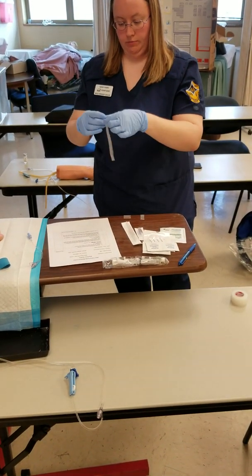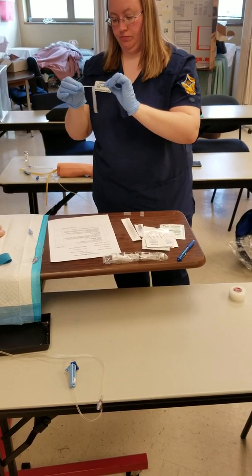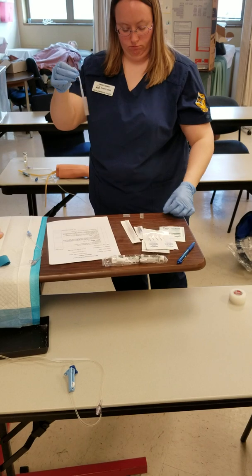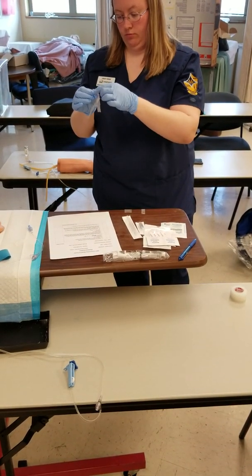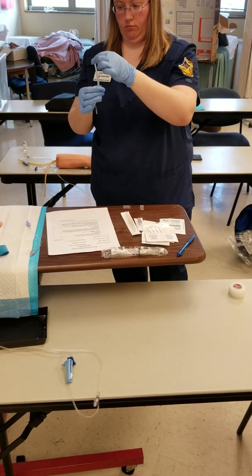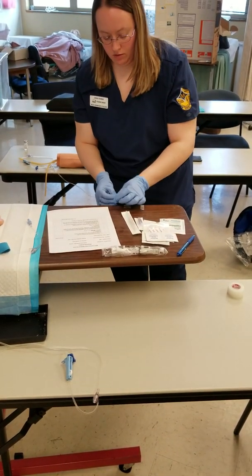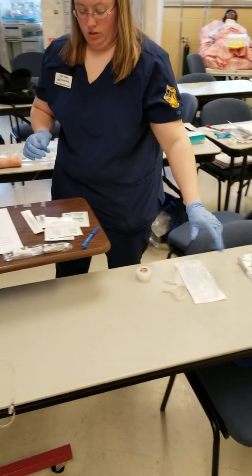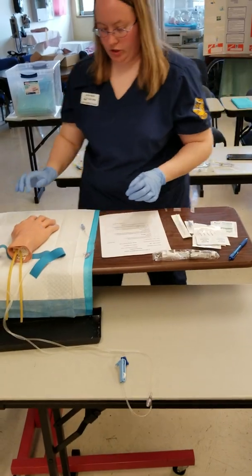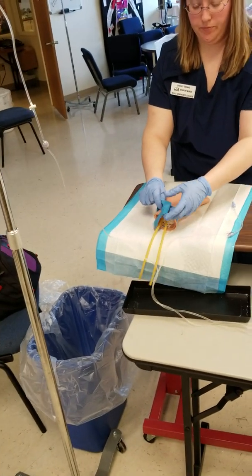Create the chevron. That's ready to go. Okay. And then I'm going to reapply the tourniquet to the patient's arm.